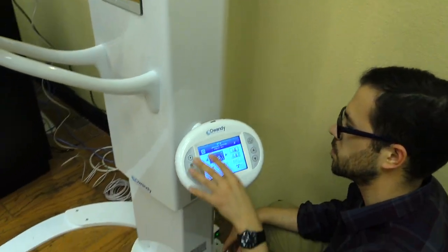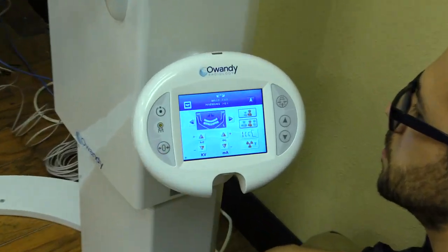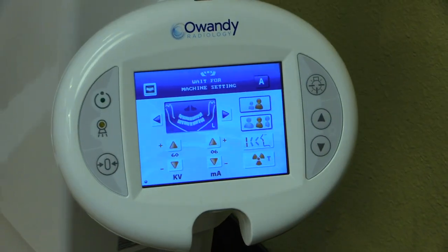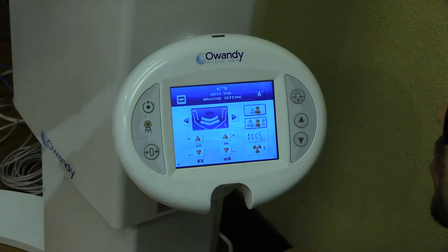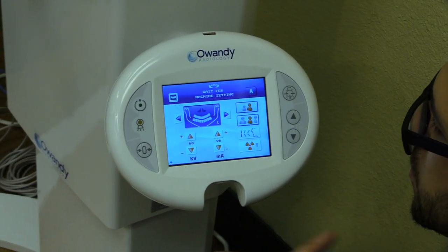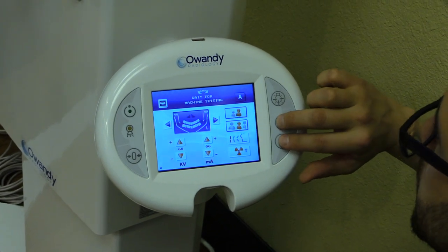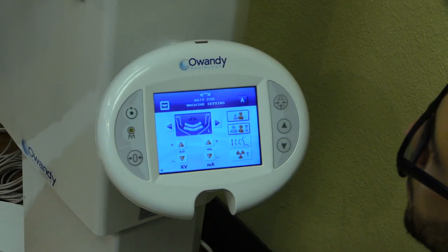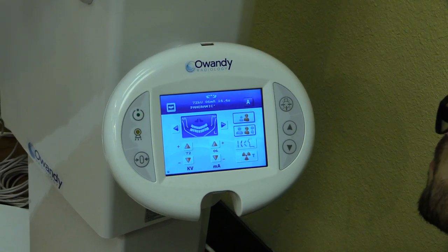The machine says 'machine setting, press zero' — I'm going to hit zero. I'll show you how to enter the configuration menu when the system is already turned on. Previously I showed you how to restart the system and wait until the words 'test' flash, then press and hold the up and down arrows. Now I'll show you how to access the service menu when the system is already on.